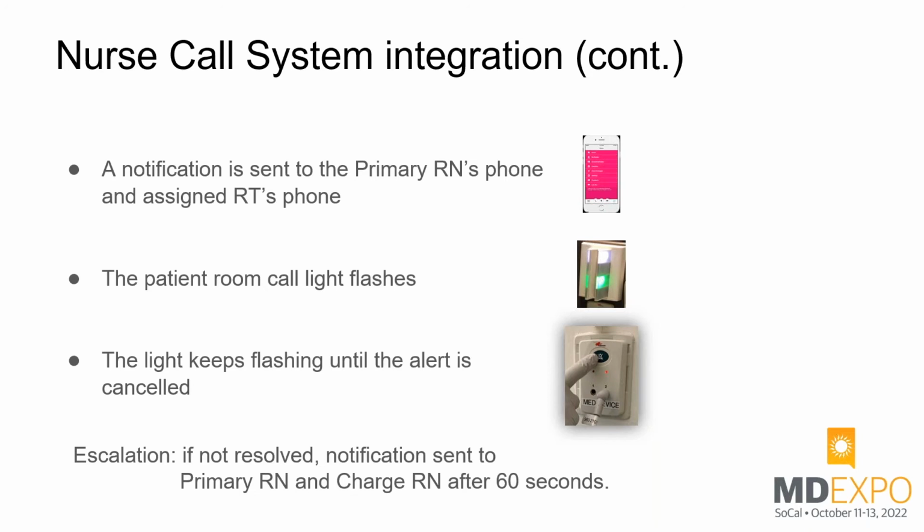Of course, if the alert is canceled at the nurse call system, but it is not addressed at the actual source, the Bipap would not generate once again an alert. So the understanding is that whenever the caregiver cancels the call at the nurse call system, they need actually to take care of it, to understand what is going on and resolve the alarm condition.